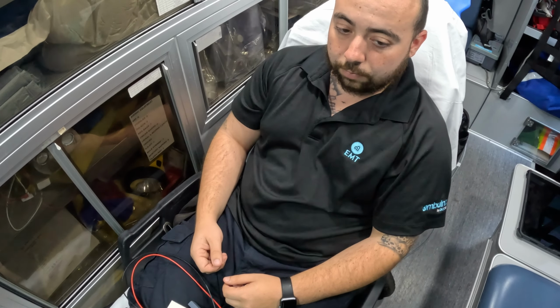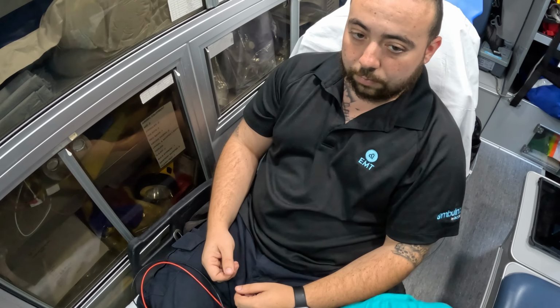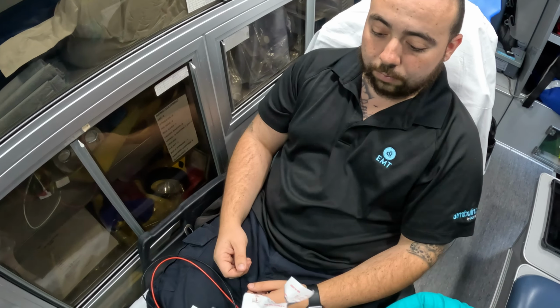Next thing I'm going to do is I'm going to take an alcohol prep, and I usually like to do a good skin prep, right? The reason why is your skin has dead skin cells, and you may not get good conduction if you just place the leads, right? It will be all right, but if you want the best picture of the heart, you want to do a good skin prep. So I just abrade the skin.